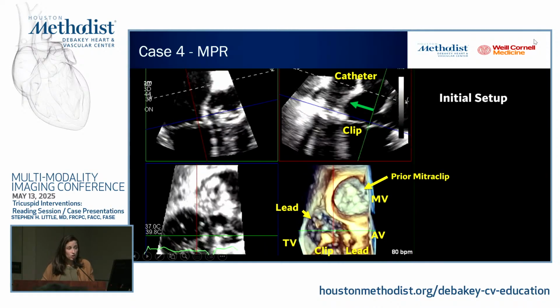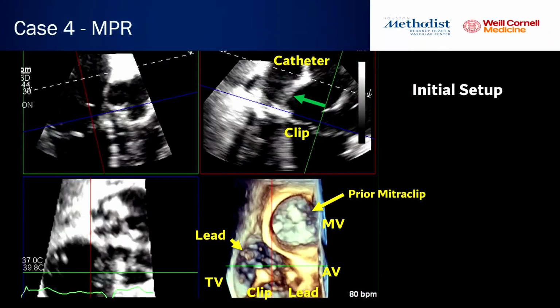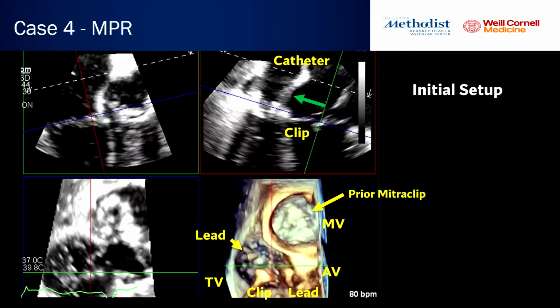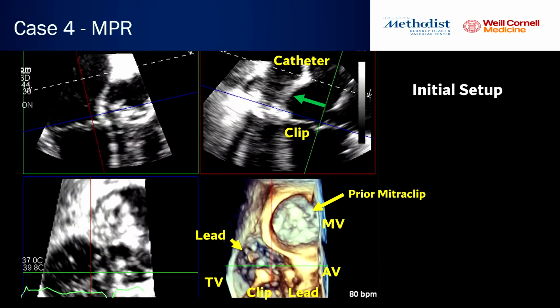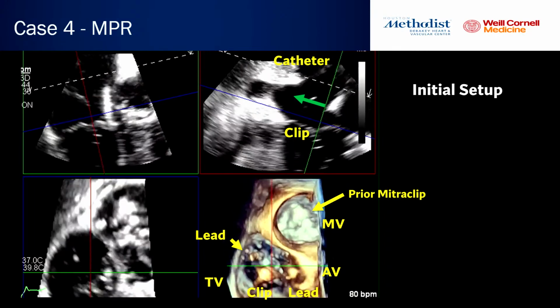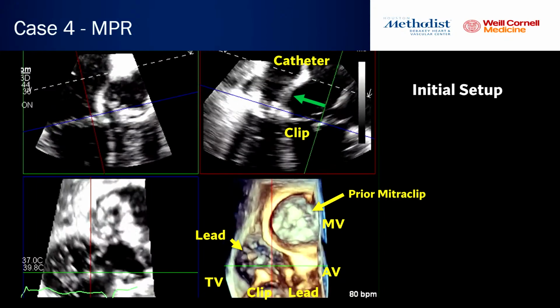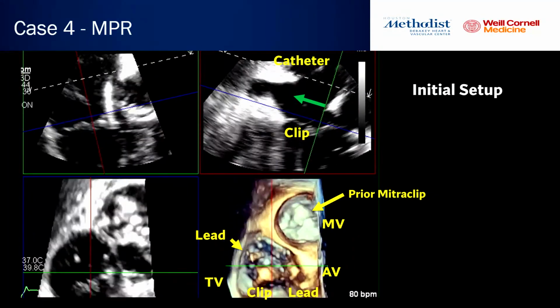All right, so the last case that we're going to discuss here is a case that Dr. Little and Catherine did yesterday, which is also a case that we discussed on the screening. It's the case that we showed for screening because it has very good pictures. But the interesting aspect of this patient's case is that we used MPR for a good part of the case. So it did not require ICE, and it shows how helpful an MPR reconstruction can be. So I'll go through each step of your MPR assessment.